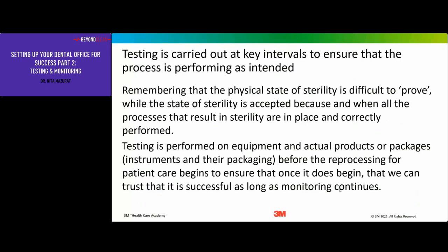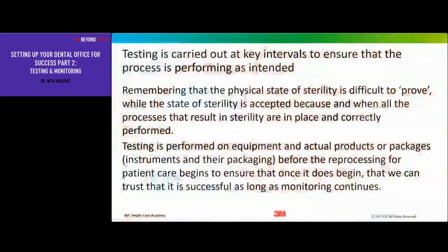The key part of this is that the physical state of sterility is difficult to prove. It's a state of nothing. It's a state where all microorganisms have been destroyed. So as soon as you touch something, of course, we're depositing microorganisms again. So it's very difficult to prove, especially clinically. So we have to accept the state of sterility has occurred because all the processes that result in sterility are in place and they've been correctly performed.